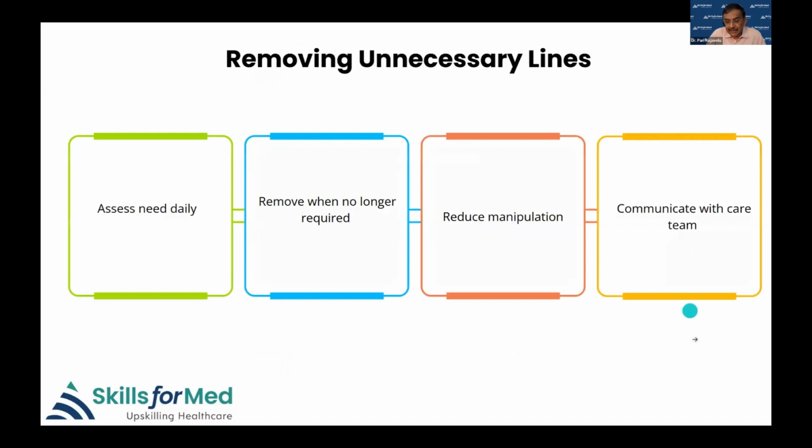So again, we keep telling this again and again: remove unnecessary lines, assess daily, remove when no longer required, reduce manipulation. So if the line is blocked, don't try to manipulate it and make it work. You can probably try it once, but don't try it too many times, because more handling, more infection. And if there are any concerns, communicate to the care team. Next slide.